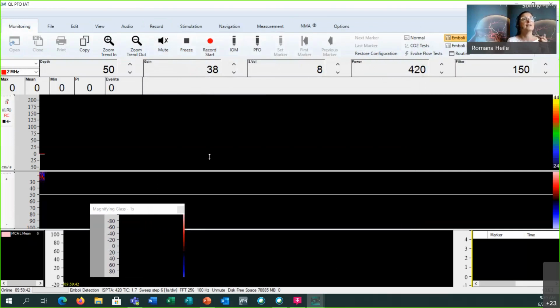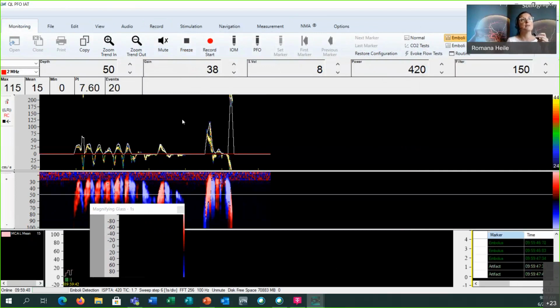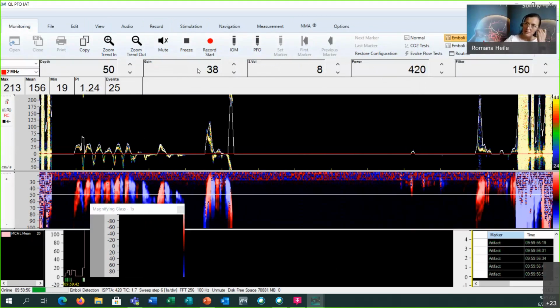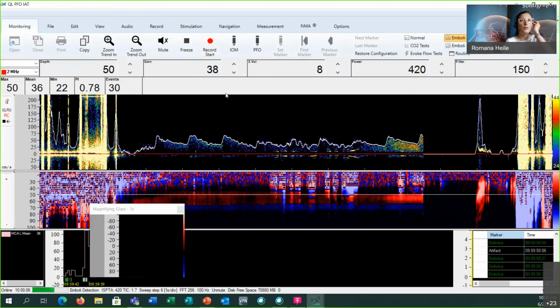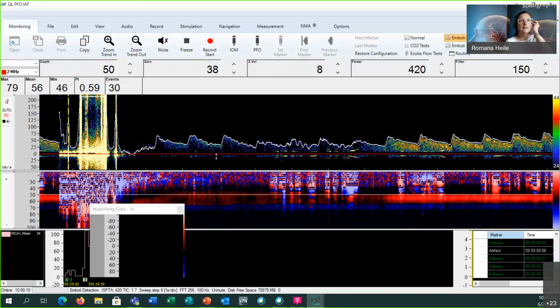We go online. We make sure that we find the MCA and that we get a stable signal. We set the parameters. Don't forget, well, maybe I can show it. Don't forget to set the gain and the power in a way that we have a shiny signal.